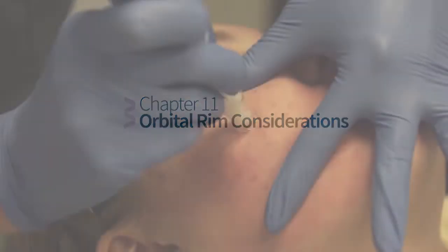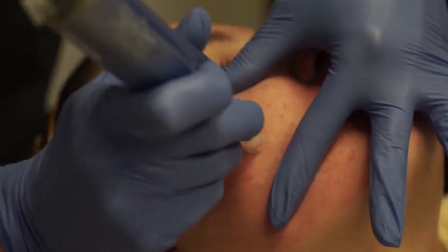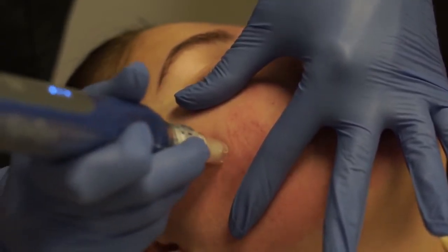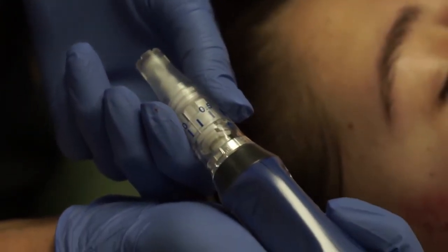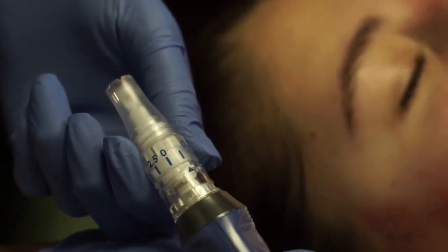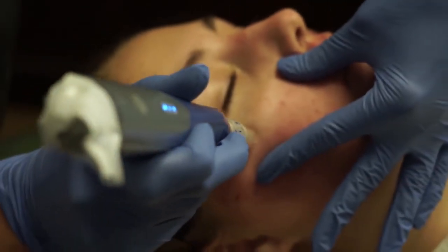As you move up the cheek or near the orbital rim, to avoid treating too closely to the eye area, you can place your thumb on the top of the cheekbone or the orbital rim as a guide and to help hold the skin taut. Once you are ready to treat the orbital rim area, it's time to dial the depth down. It's suggested to begin at a depth of 0.25 millimeters, staying in the range of 0.25 millimeters to 0.5 millimeters.